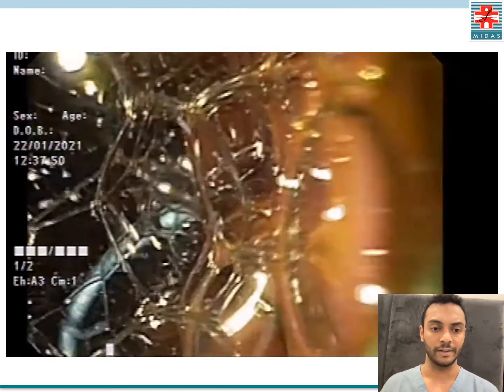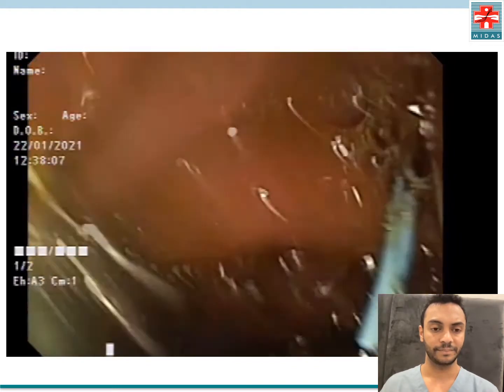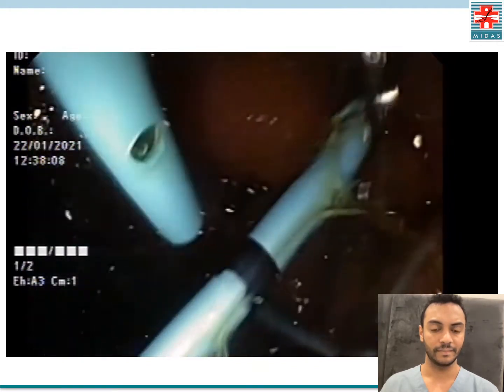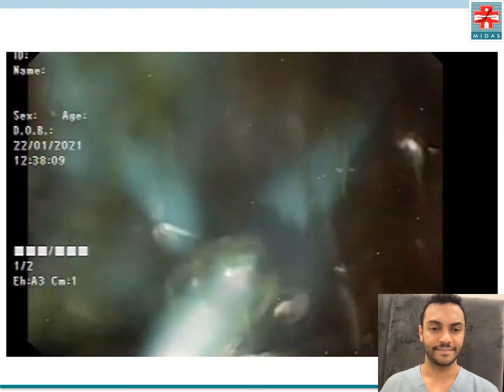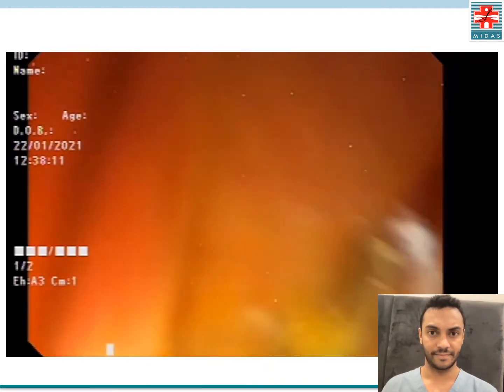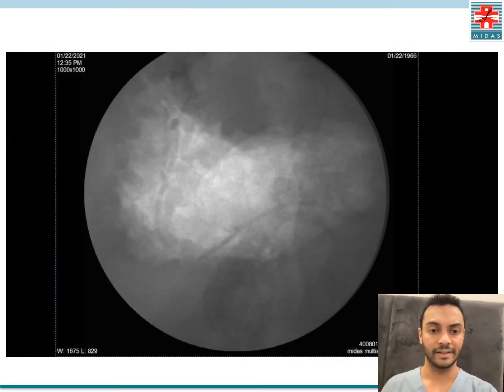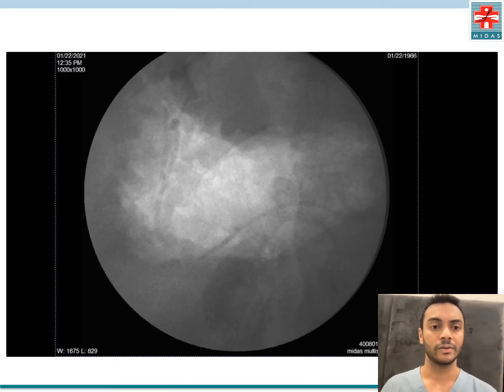You can see the coil, and on the fluoroscopy you see the stent in the pancreatic duct down to the tail and the loop in the gastric lumen.